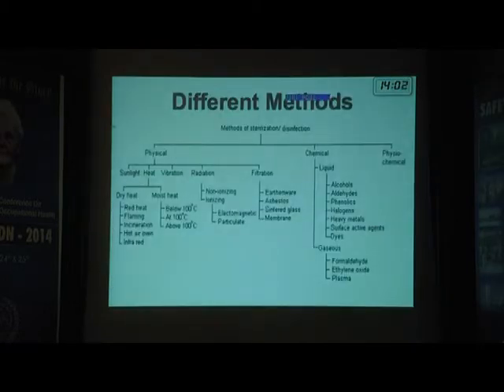So, the different methods of sterilization and disinfection. Sterilization, I think you've heard a little bit from Dr. Walson's talk also. You have heat, and you have radiation and filtration. With radiation, you've heard a little bit about UV rays. Under heat, you have moist heat and dry heat, which is what we're going to look at very briefly today.